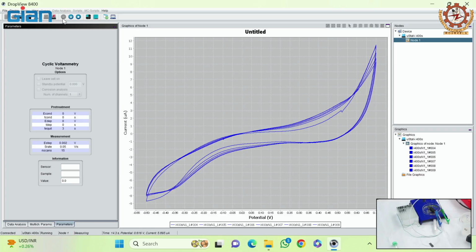So there are two more steps to go. Once the CV is completed, then we will do a stabilization step, and then the last step would be calibration. In calibration, we will check what is the linear range of our sensor by using known concentrations of glucose.